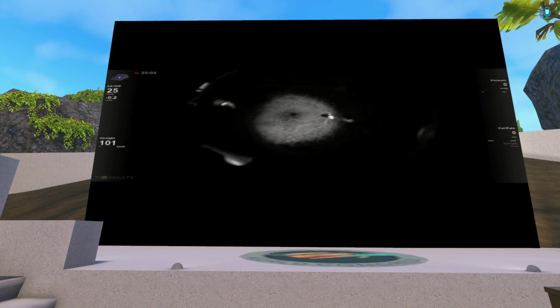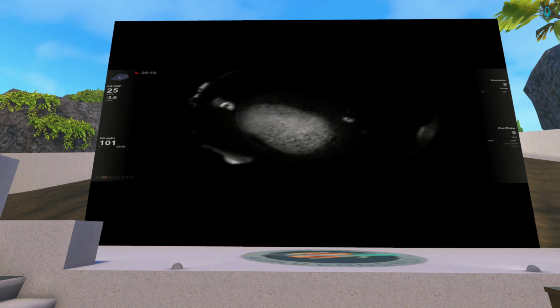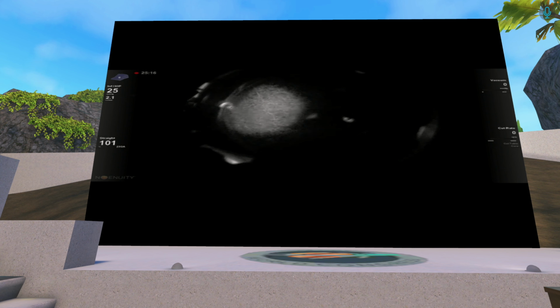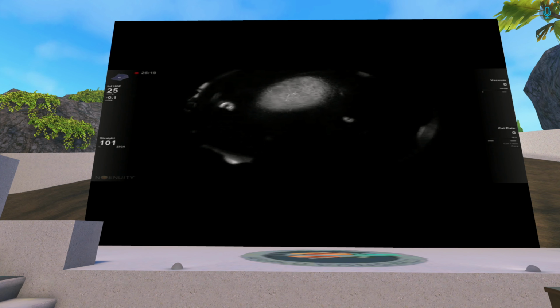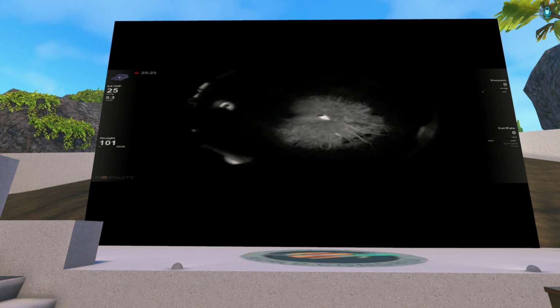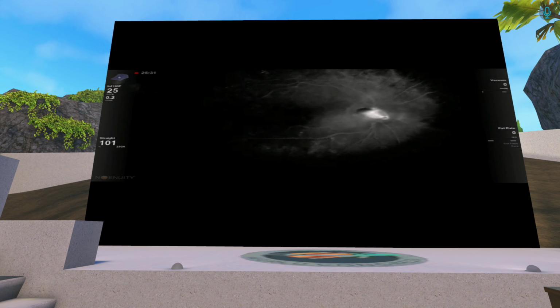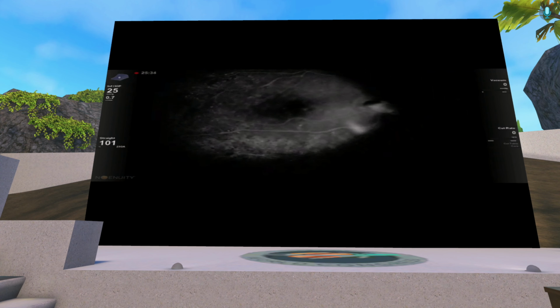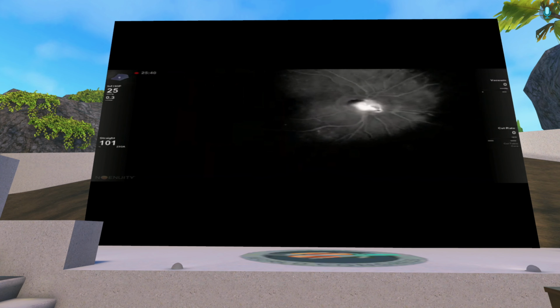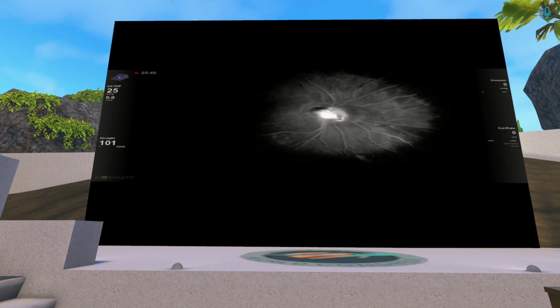I think that Michael Cardamone talks about just when you're setting up for intraoperative FA, you need to do all the basics of good microscopy in terms of having your lenses clear, being parfocal. No, I'm basically talking about the quality of the optical parts of the microscopes. They all use different types of glass inside, coatings and things like that. And I found that the microscope, basically the objective of our camera, has a huge role in the image.